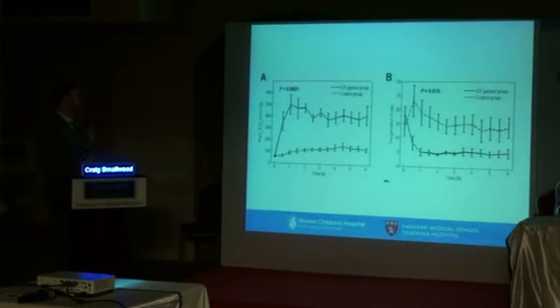So here are probably two of the more important slides to take away from this publication. We look at oxygenation by PF ratio, and we also look at time. So you can see the control is this dash line here, and the EIT guided group was the solid line. And what we found was a statistically significantly different difference in oxygenation. And you can see here that from baseline, there was a real gigantic improvement in oxygenation in the EIT group that just wasn't really ever resolved with the ARDSNet protocolized controlled ventilation.